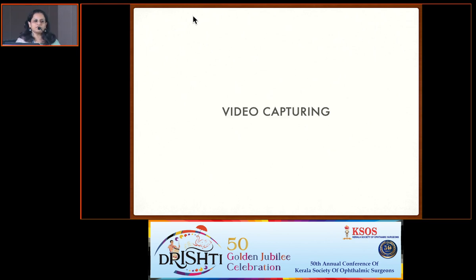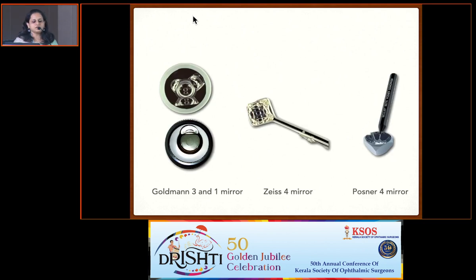But now we have all gone paperless. Now everything is shifting to the EMR. So having this goniogram is a little difficult. So the next era is of video capturing and photos, which we have already seen many photos. So for video capturing, this is to document your findings, convenient for patient education and easy integration into network. So the question comes, which mirror you can use for the video capturing.